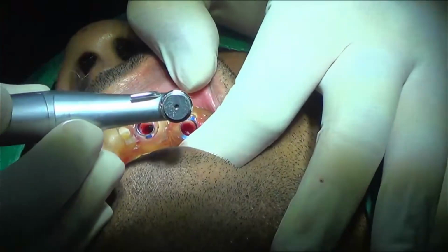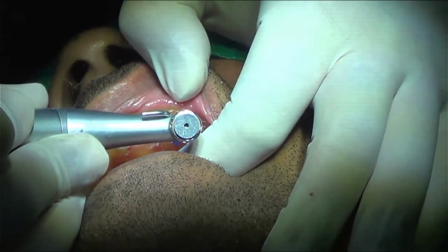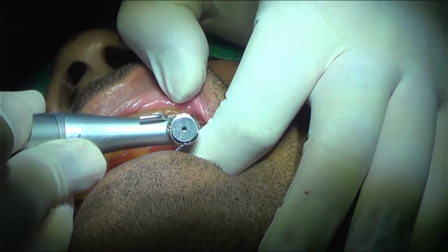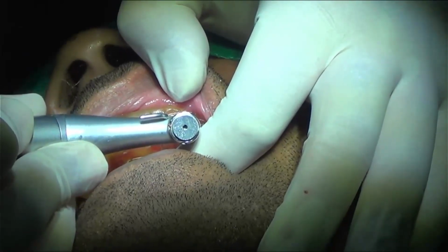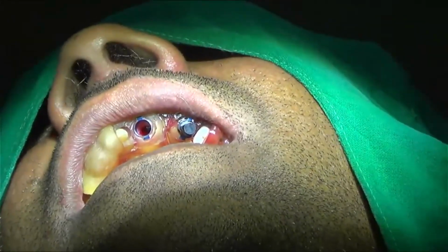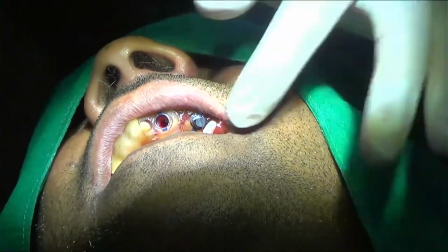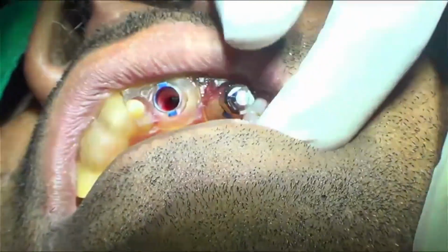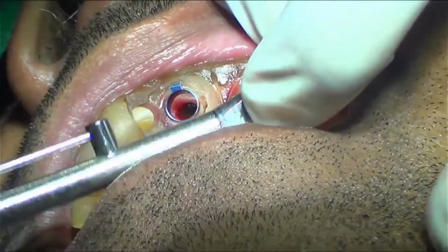Implant mode. Engage the osteotomy. Again same, I have to go. So this is the most ideal thing that you can do, that when it is 1 or 2 mm remaining, you need to hand tighten it. Ideally it should happen that when 2 mm is remaining and you reach adequate torque, the rest of the torque you control with hand.